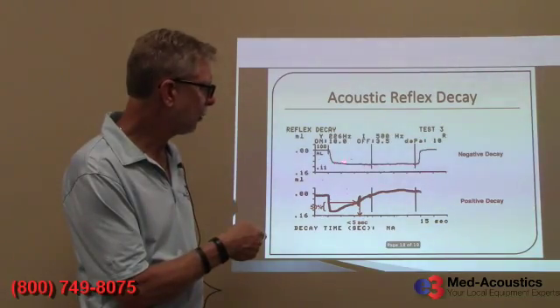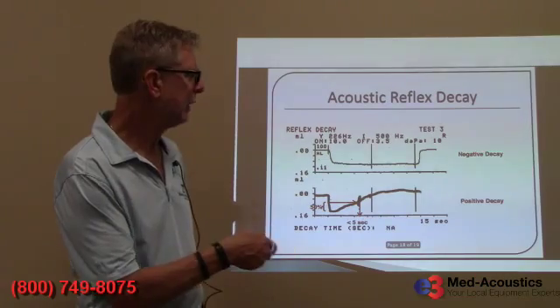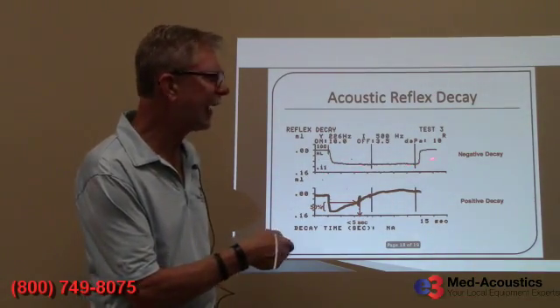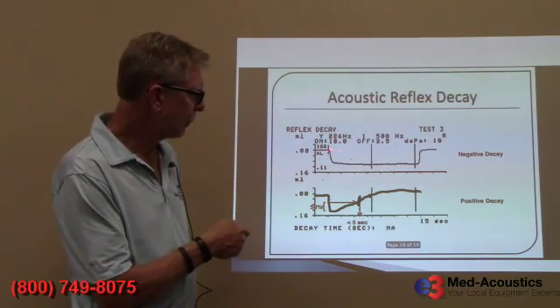Then hold that for a period of 10 seconds and release it, and see no decay in the reflex. Okay? So this would be normal.